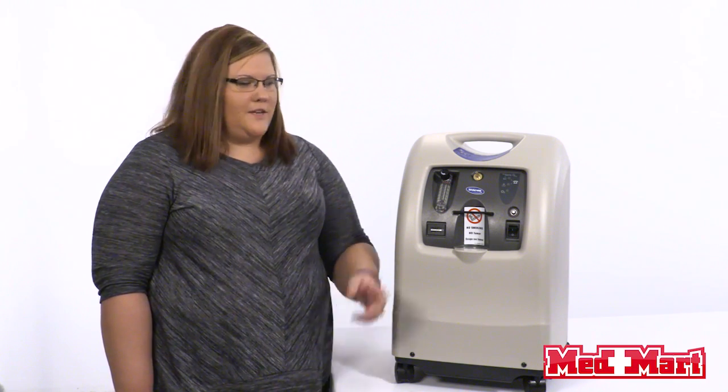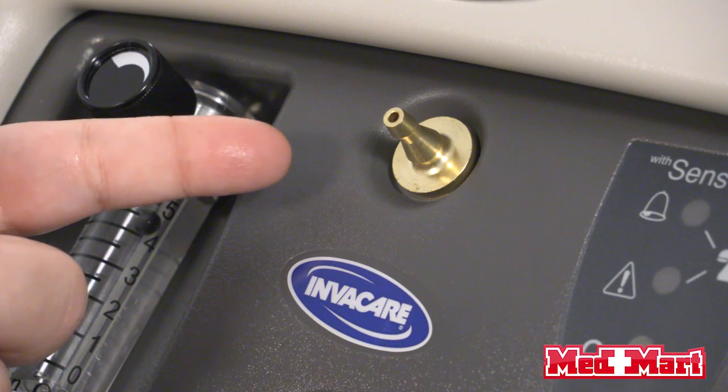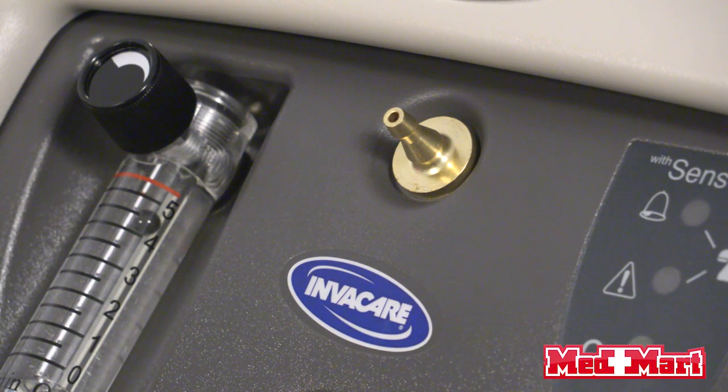A few things we like about this concentrator: it's been out on the market since 2007. On the machine you'll notice a brass nipple — that's where you connect your tubing, and it's not going to break as easily as the other ones.